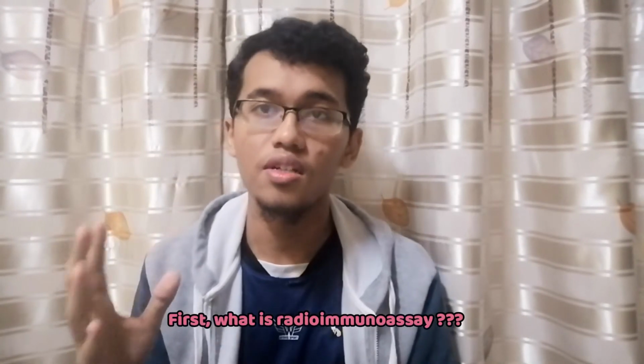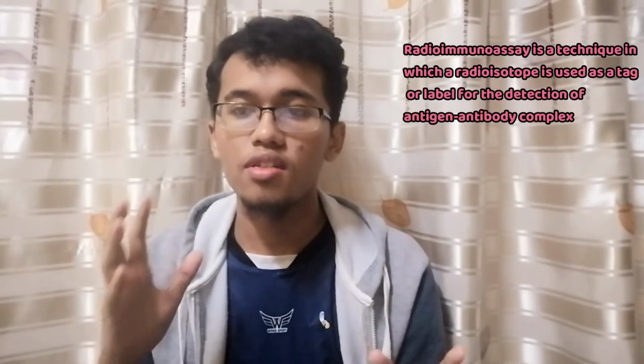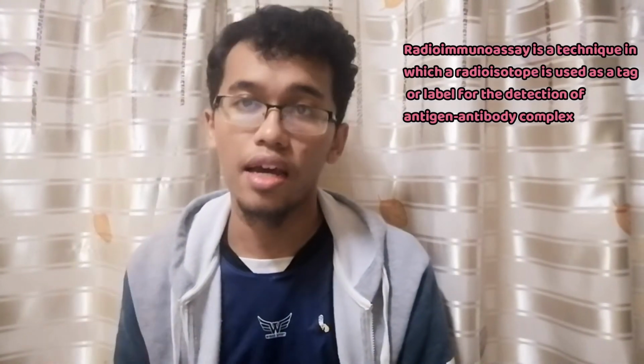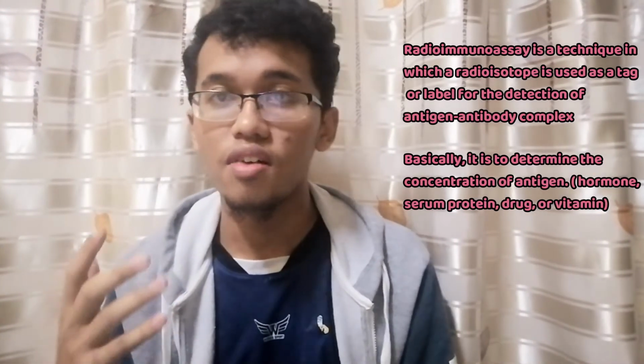Radioimmunoassay. First, what is radioimmunoassay? Radioimmunoassay is a technique in which a radioisotope is used as a tag or label for the detection of antigen-antibody complex. Basically, it is to determine the concentration of antigen.